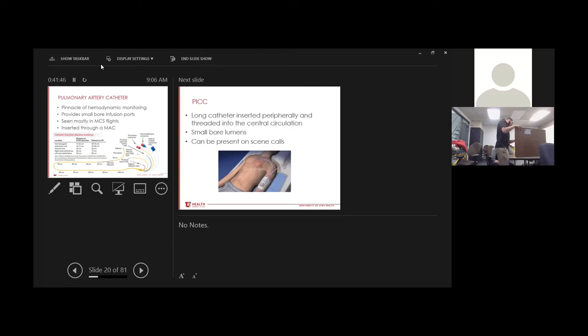Yep. Now that we've put the SWAN in there, we've taken up most of the space in the sheath. This is still your best infusion port, but it's going to be a lot slower than it used to be. So you can see this SWAN stuffs that sheath full. If someone becomes a trauma patient and you're mass transfusing because they are bleeding, you might want to consider pulling the SWAN. It's not really something you're going to come across, but it happens in the ICU. You just pull it back and leave it in its cover.